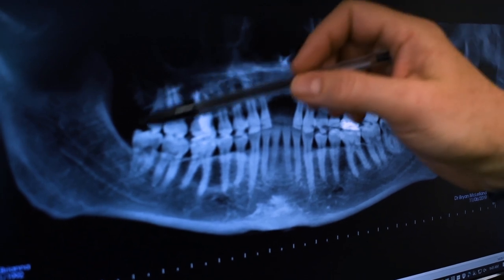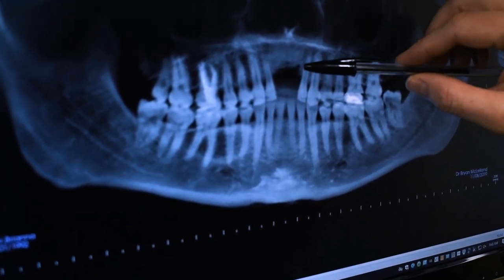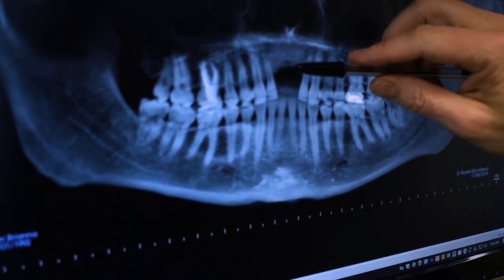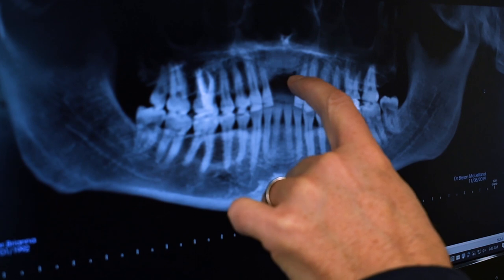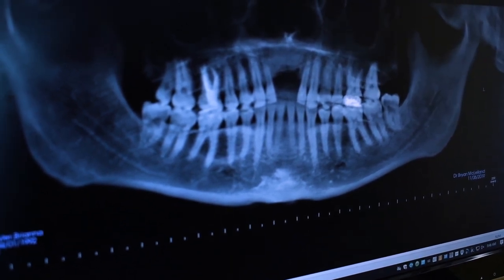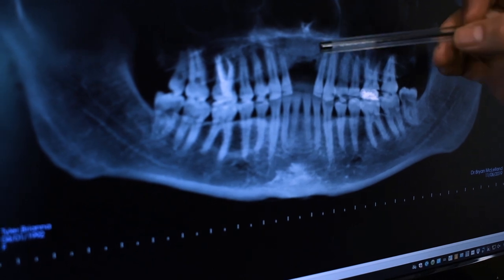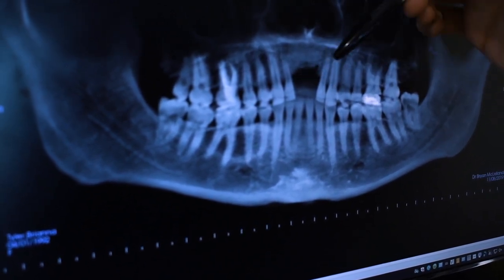Coming up you'll see extraction of these wisdom teeth - we'll make that pretty brief and focus more on the placement of the implants. In order to preserve the interproximal bone between the two implants, I'm going to use an Astra implant - 4.2 by 11, possibly 13 millimeters in length - engineered so the fixture head sits at the correct level on both sides to help maintain interproximal bone and soft tissue. I will also take a fixture-level impression so that while these are integrating over four to six months, we can make temporary restorations to have the soft tissue heal and achieve a normal scalloped appearance.